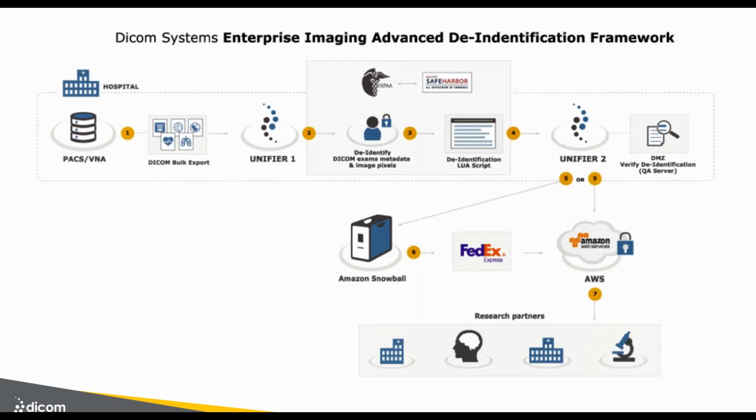run. So once this de-identified data is out in the cloud, then it can be made available to outside research partners. And so that's the end goal, and we know it's cleaned, we know it's been normalized, and we were really excited to be able to provide this framework that works really great for them.